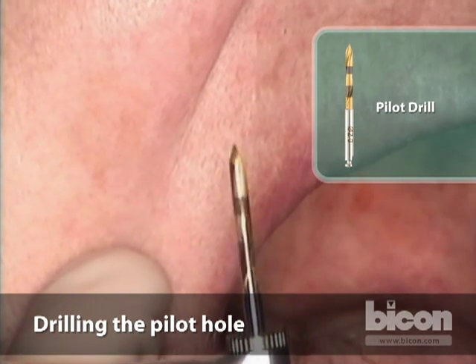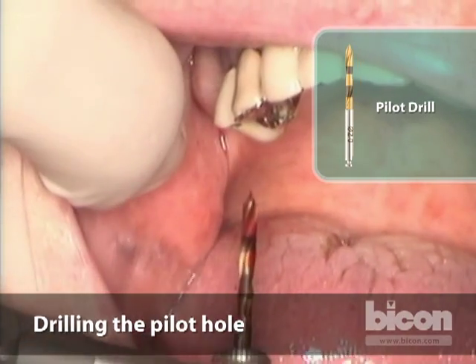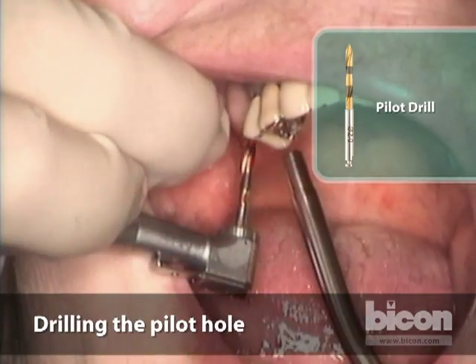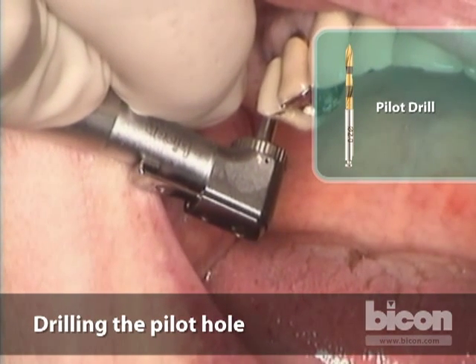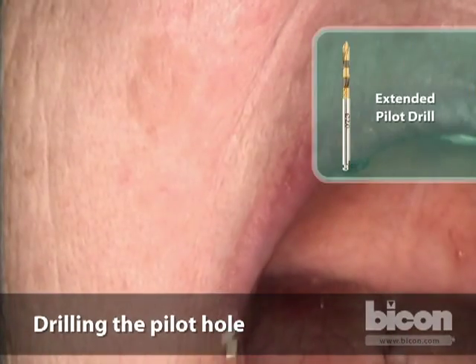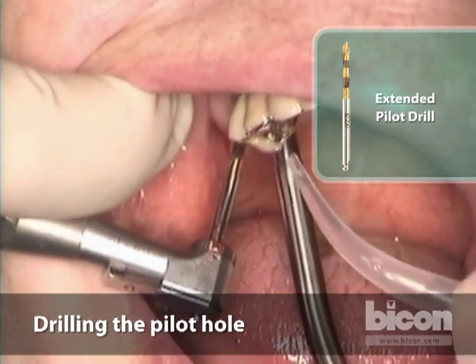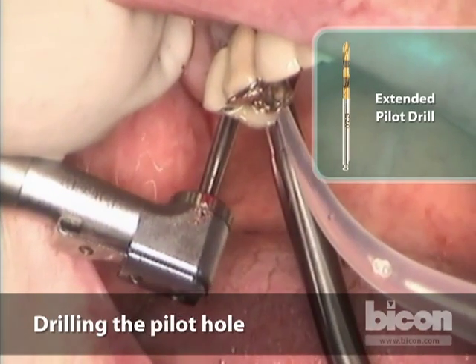Looking at the pilot drill, when we rotate at about 1,100 RPM you can easily see those bands. Because we are rotating at such a high speed we risk thermal trauma to the bone, so we do irrigate. If we had to use hand reamers at this angle, we wouldn't be able to because they would come in direct collision with the mandible. For that reason, because the implant allows that latitude, we're able to angle ever so slightly — roughly 10 degrees — staying within the confines of the occlusion and intended crowns while avoiding mandibular interference. The slightly longer pilot drill gives a better indication of direction.